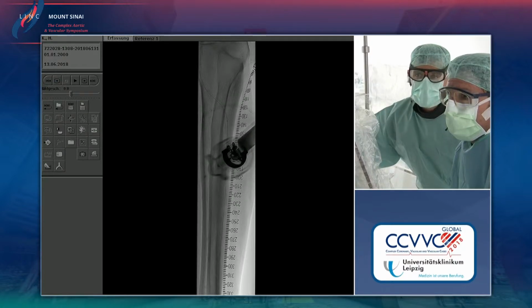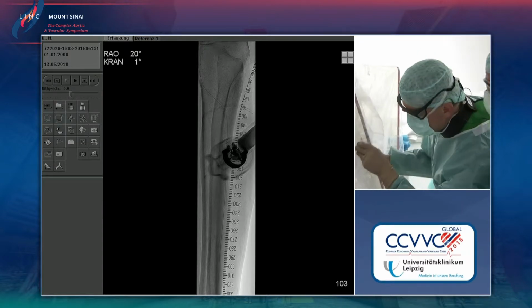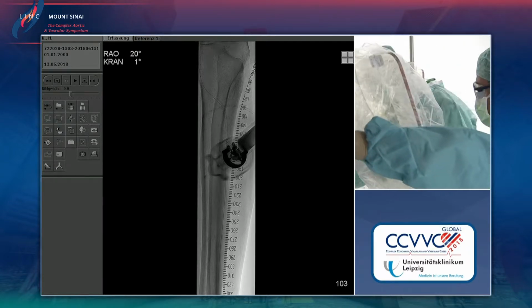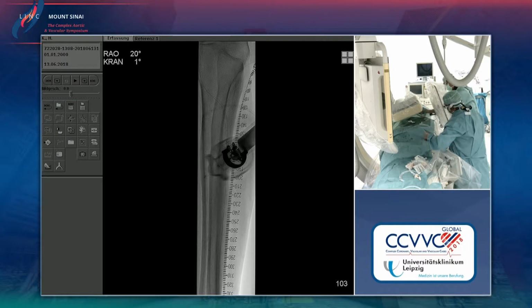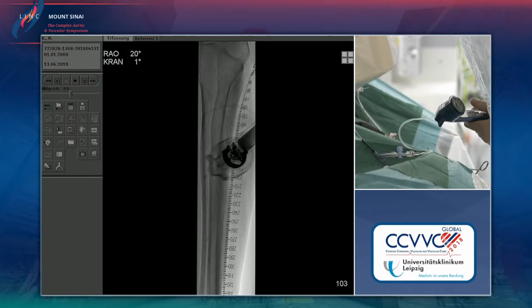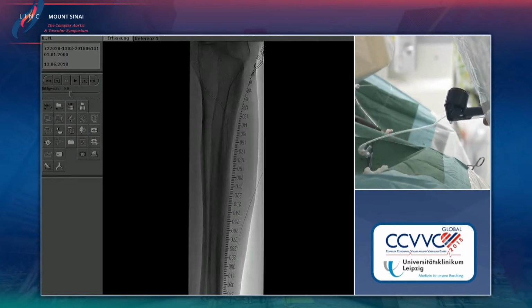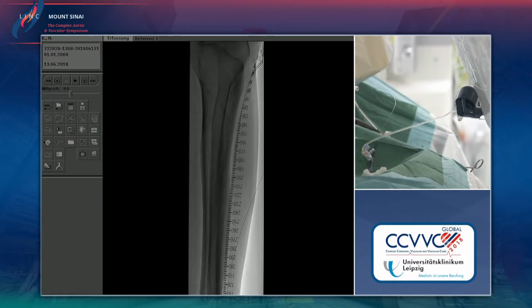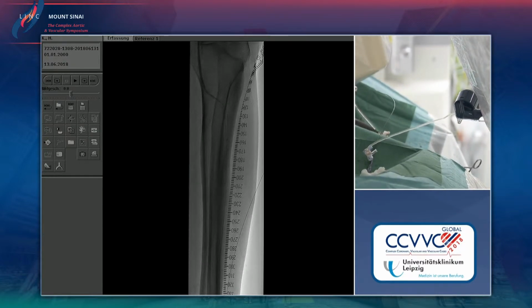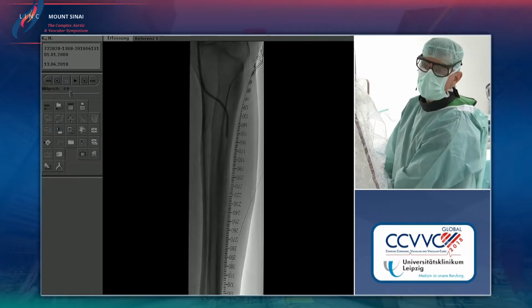So did you get stuck with the Bullfrog proximal, or why are you going in again? Using a bigger balloon, because we saw on the previous angio some residual stenosis proximal at the anterior origin. So that's why I take 3.0 now. Just going a little bit into the anterior here. This pushes again. Now this is okay for him.